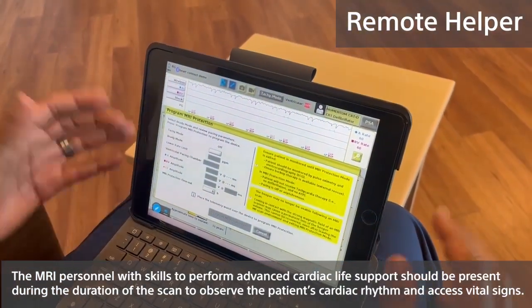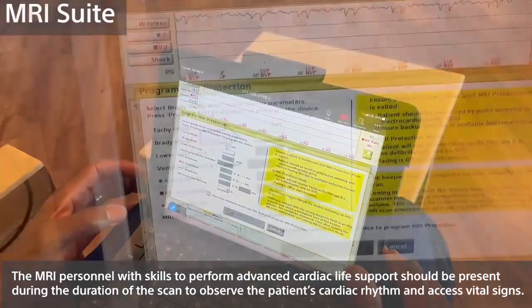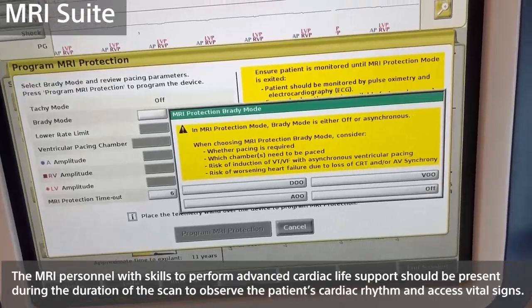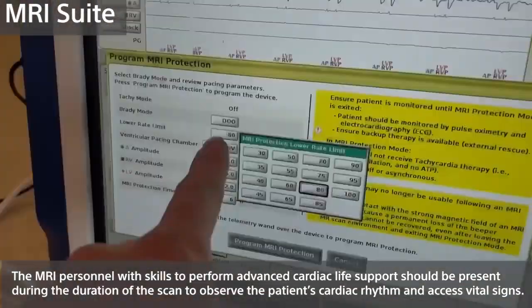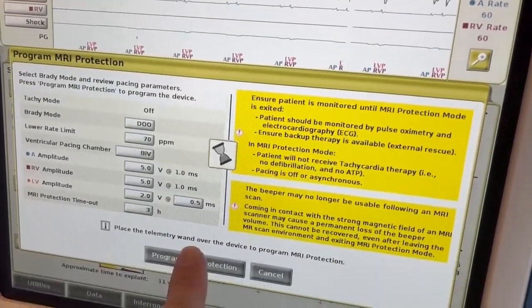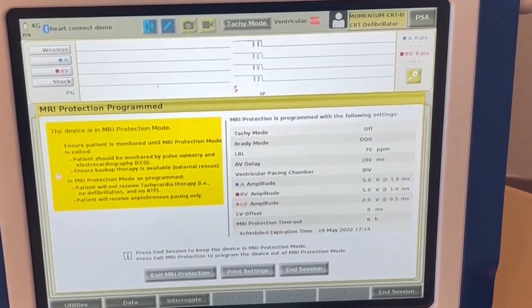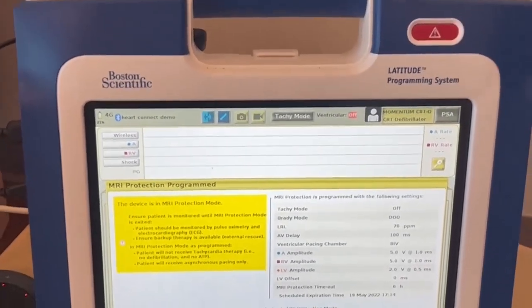Next, we're going to select our mode and rate. Under Brady Mode located right here, I want you to click that button. Here's where I select the mode of DOO, and then I need to change the rate from 80 to 70. Got it. You'll see your settings that the device is programmed to on the far right-hand side of your screen, and you can print those here if need be.